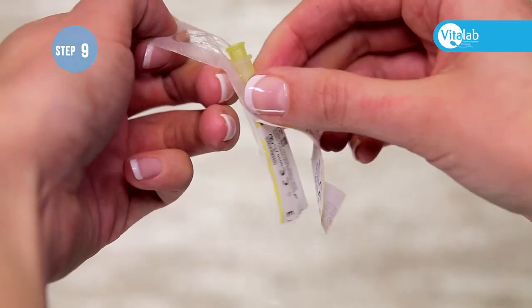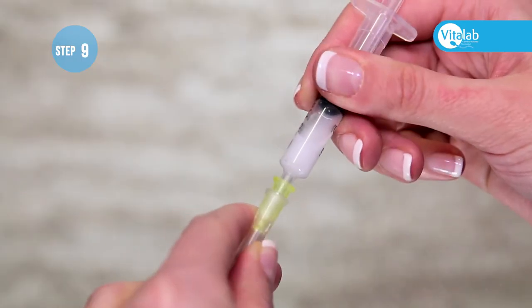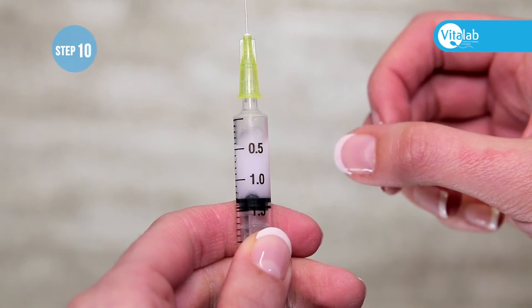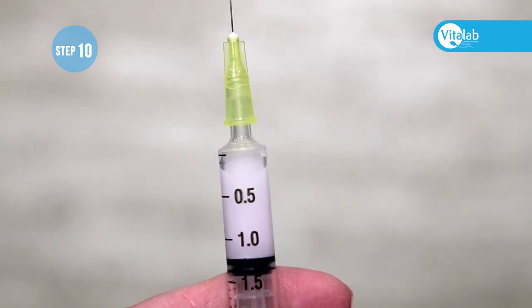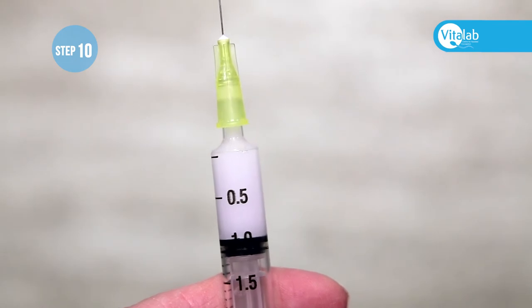Remove the small needle from the packaging and tightly screw it onto the syringe. Remove the plastic cap and hold the syringe upright while tapping to get all the air to the top. Gently push all the air out of the syringe until you see the medication appear in the colored part of the needle.